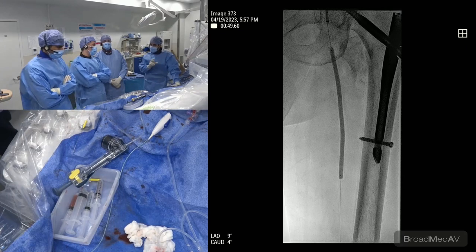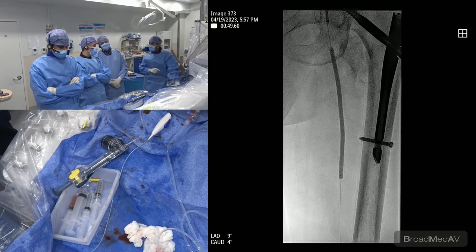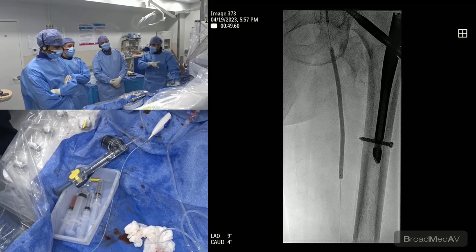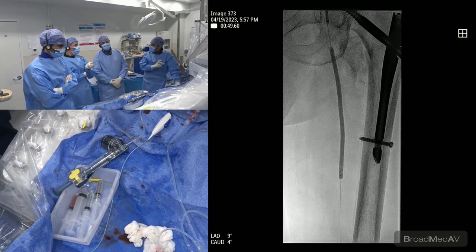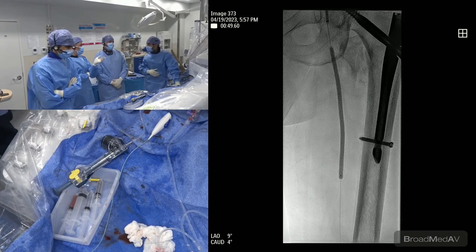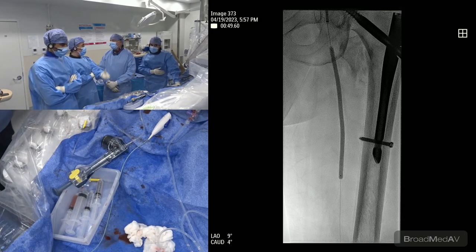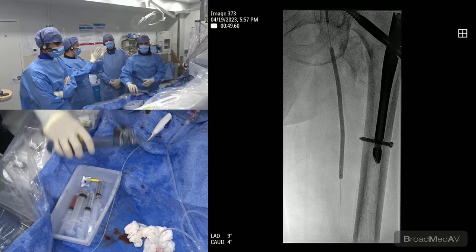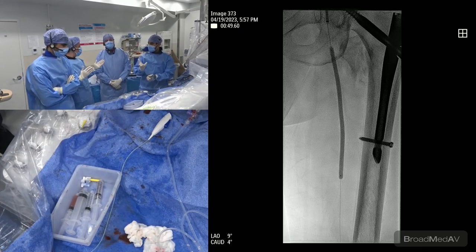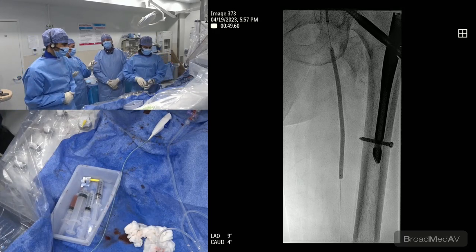And there's also the fact that objectively the size of the vessel at that CTO segment was actually 6.67, almost 7 millimeters. But for the 7 millimeter DCB, the proximal measurements were much closer to a 5.5, right? So with that size mismatch, one would be either overtreated or undertreated, and one would be dissected, and you end up with a full metal jacket. Exactly. But that reinforces the idea that the disease is extending more proximally, because usually the vessels taper down. They're not small and suddenly become big.